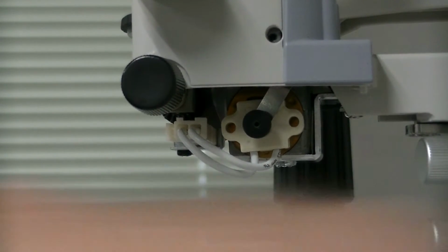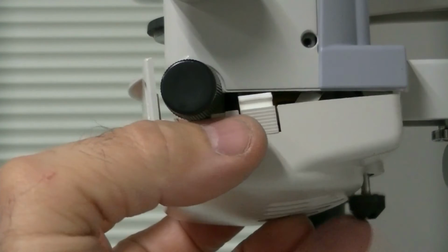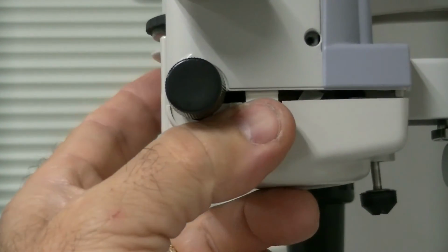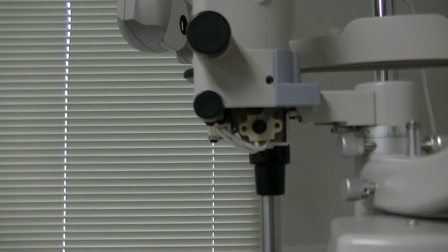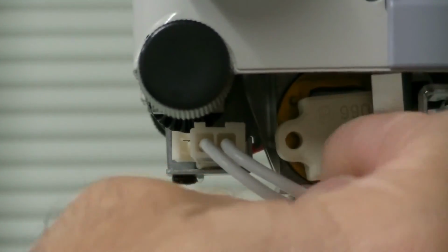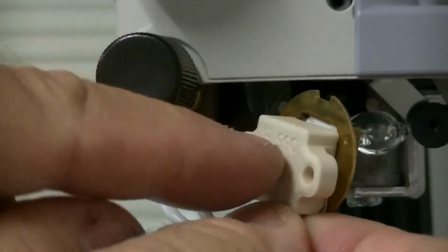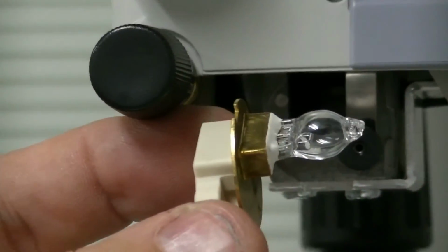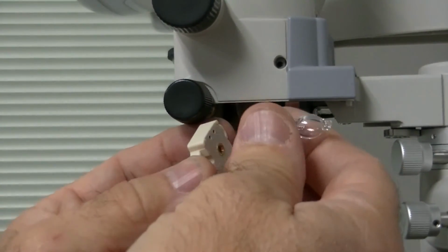So to review, after you take off your plastic piece here by unscrewing this screw right here and squeezing on these two plastic serrated areas, allow this to come off the unit, set it aside, take this black knob on the silver tab, pull it away so it's free, pull this straight out where that keyway is, hold the lamp socket and the bulb, and pull them apart so that they're apart.